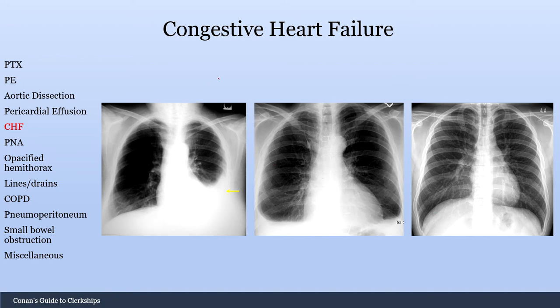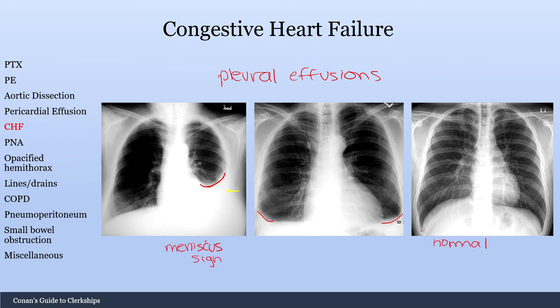Let's talk about pleural effusions. On the left there's clearly a large effusion — this is called the meniscus sign. In the middle image it may be harder to appreciate, but you have costophrenic angle blunting, showing small bilateral pleural effusions. A normal chest X-ray on the right shows sharp angles. This is one of the most common things you'll see on the wards — you should be comfortable identifying pleural effusions even when small.